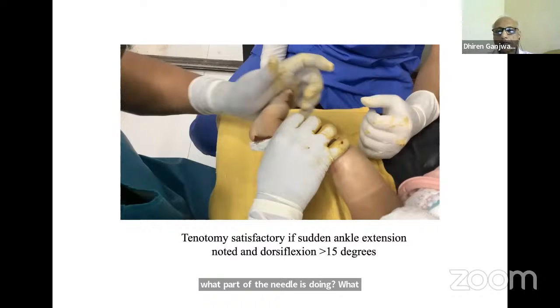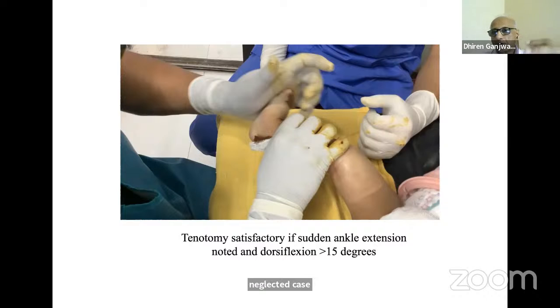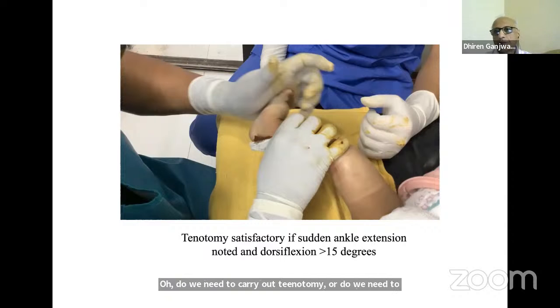Okay. Then there are two questions related to neglected feet, and we will take both questions together. The first is, in neglected cases, if there is a severe cavus present, can we consider doing a plantar fascia release by needle or by knife before starting the plaster? That is the first question. And the second question is about, in a neglected case, do we need to carry out tenotomy or do we need to do lengthening, tendo-Achilles lengthening? I would reframe the question and ask you, up to what age do you carry out tenotomy?